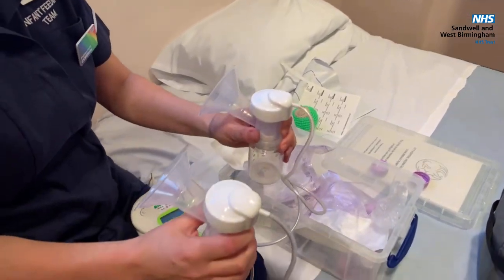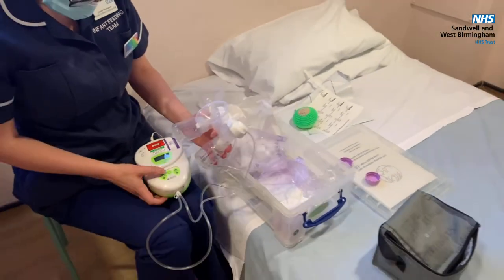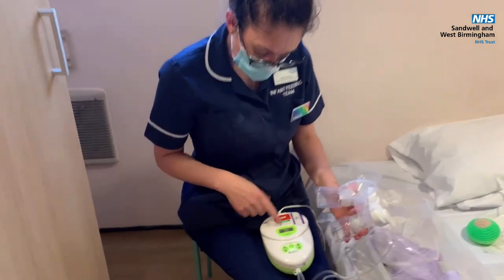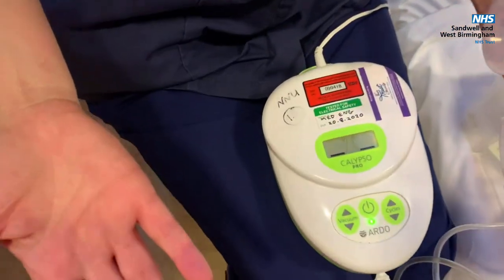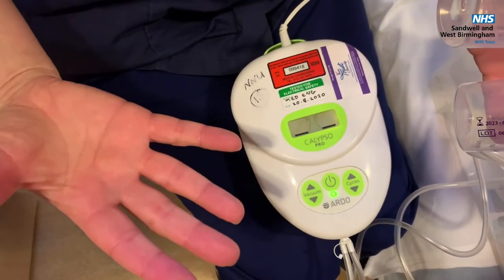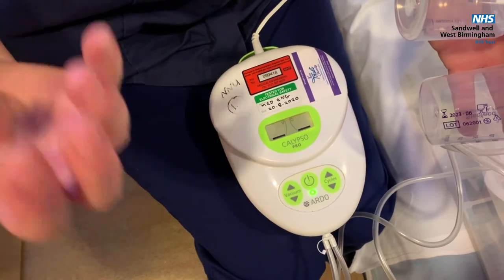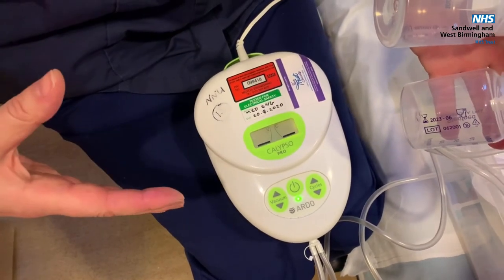So I'm all set up. I've got my pumps ready, and then I'm going to turn the pump on. When we start off the breast pump, we start it off like a baby starts when they first go on the breast and they feed. When babies first go to the breast they suck really fast, and that's to encourage your milk to let down.